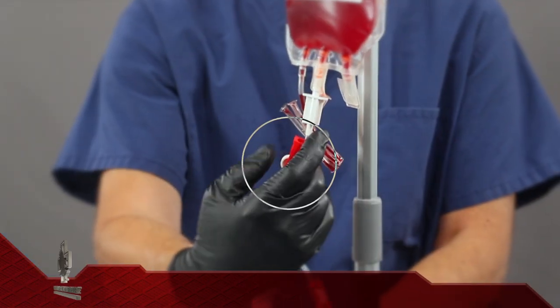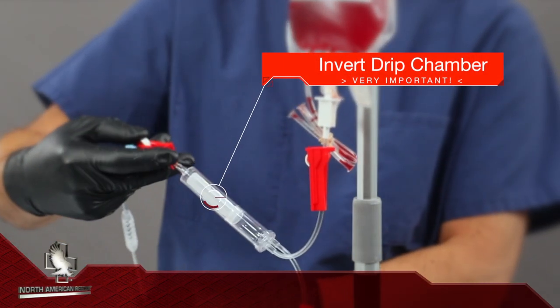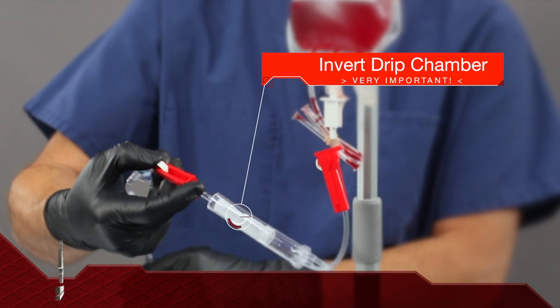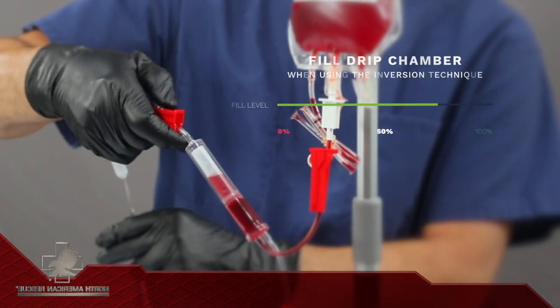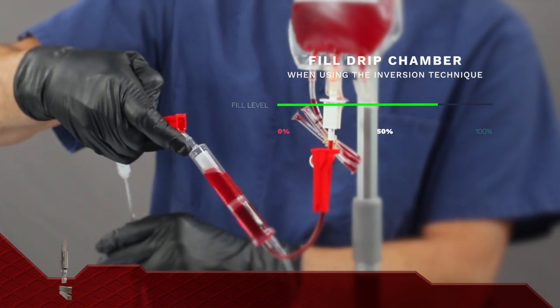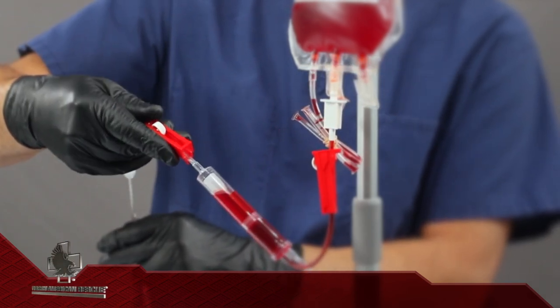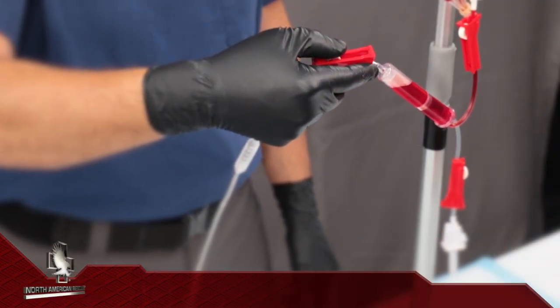Open the roller clamp under this bag. It is very important to now invert the drip chamber to facilitate proper priming. Once inverted, open the roller clamp downstream of the drip chamber and allow the inverted drip chamber to fill at least 50%, 75% is optimal, and then close the downstream clamp. This purges air from the drip chamber and filter and facilitates proper priming of the tubing.